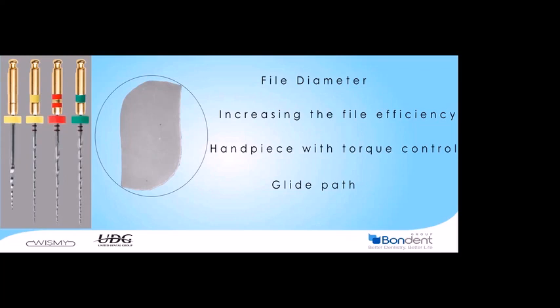In order to decrease the fractures due to torsional stress, we have to review these 4 factors: the diameter, the efficiency of the file, if we use or not a handpiece with torque control, and if we do or not glide path. The resistance to the torsional fracture increases with the diameter of the file. What does it mean? It means that the bigger files are more resistant to torsional stress.